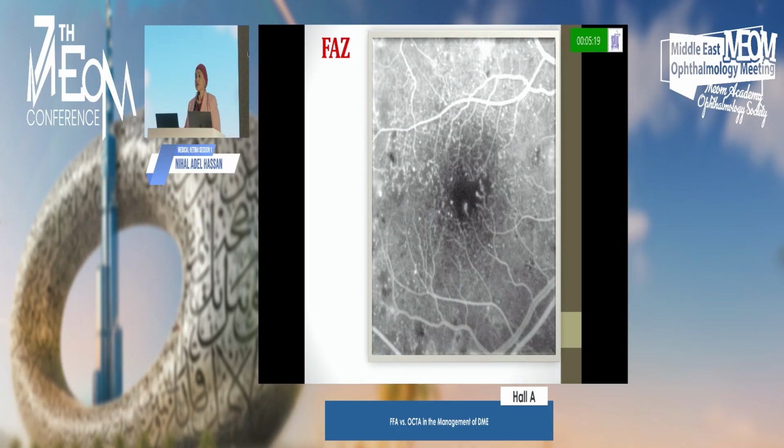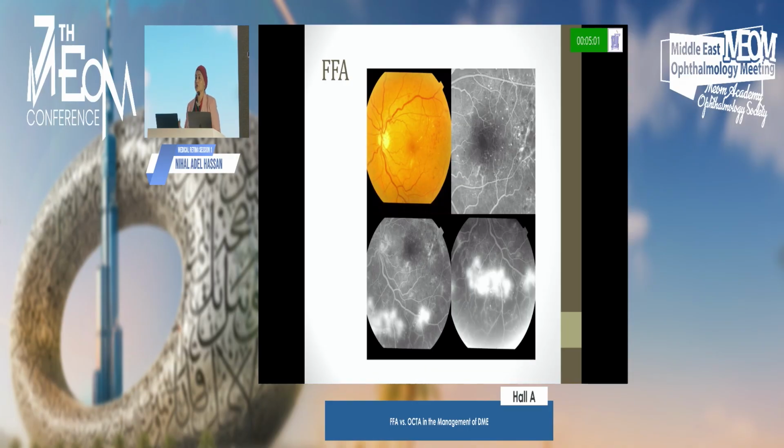And giving the foveal avascular zone, this is a fluorescein angiography. We can comment upon the irregularity of the foveal avascular zone, the fragmentation of the capillary network, the invasion of the collaterals due to the chronicity of the macular ischemia, and the starting of these telangiectatic vessels. All these we can carry out with a good fluorescein photography in the early phases, because in the late phase, with the haziness of the interrupted blood retinal barrier and the diffusion of the dye itself, the view will be hazy, especially if the patient is in early cataract.